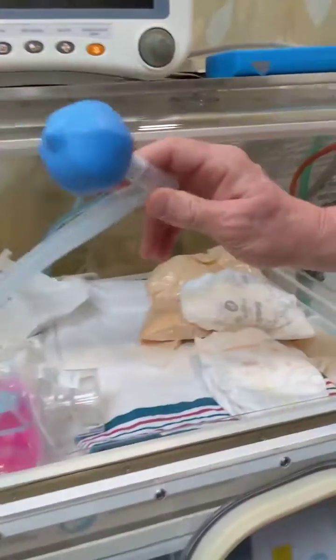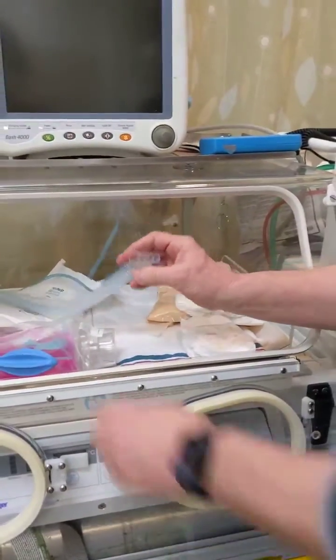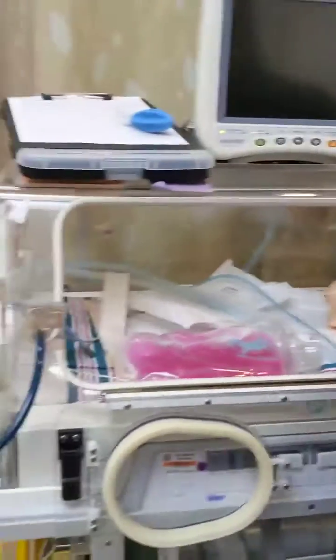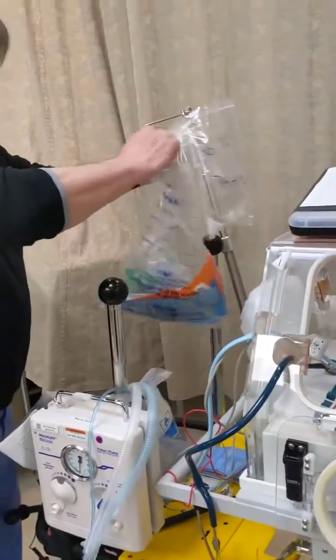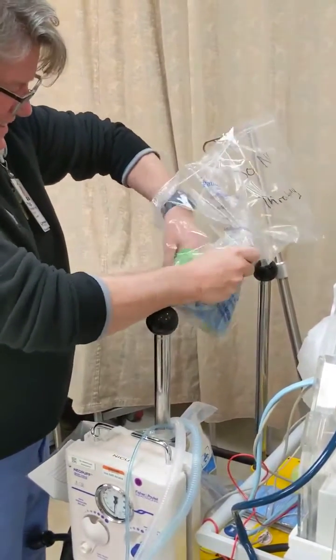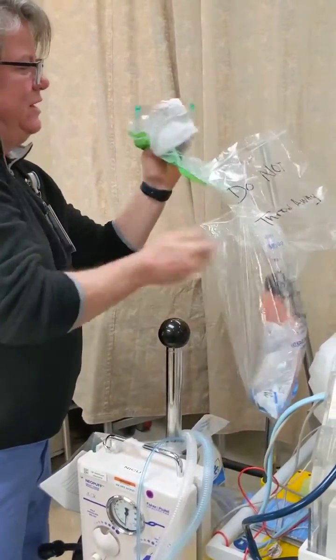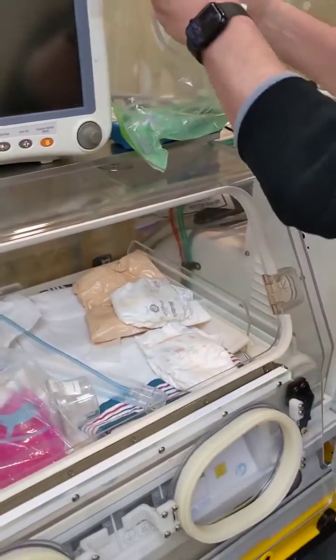To connect a baby to a RAM cannula, which is what we use for PEEP and CPAP, I would disconnect my baby, and I would reach into the respiratory bag of tricks for my pre-opened RAM cannula. The RAM cannula is the device that we're going to use in transport to deliver both high flow and CPAP if necessary.